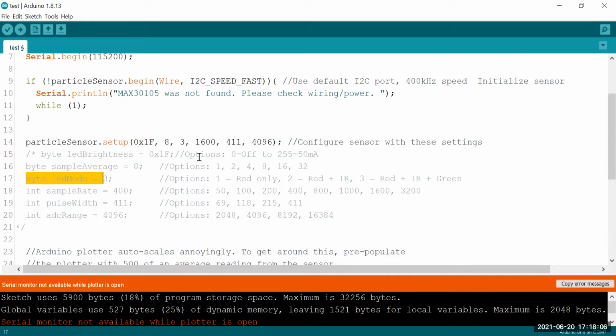The next cell is the mode of the LED. There's several different options. One's only using the pure red color. Two's using the red and infrared, and three's using red, infrared, and green LEDs all at the same time. I went ahead and just chose to do all three of them.